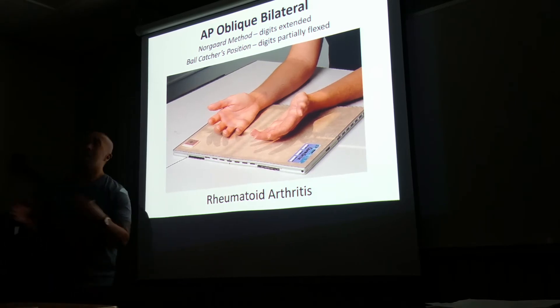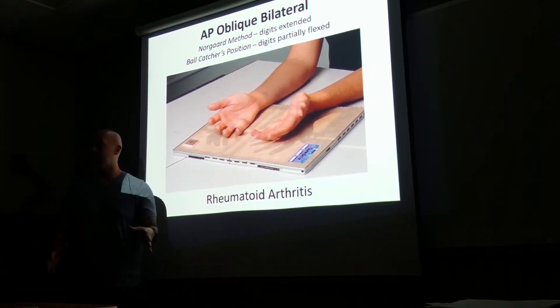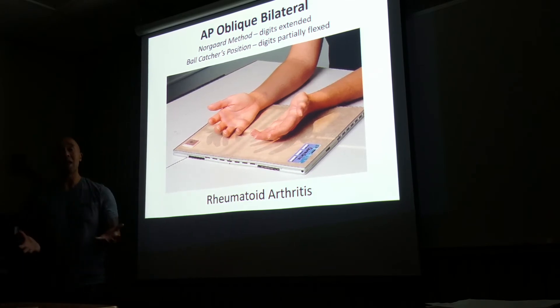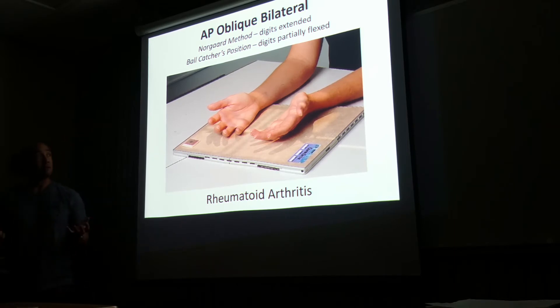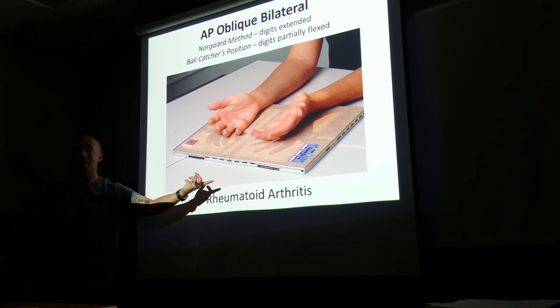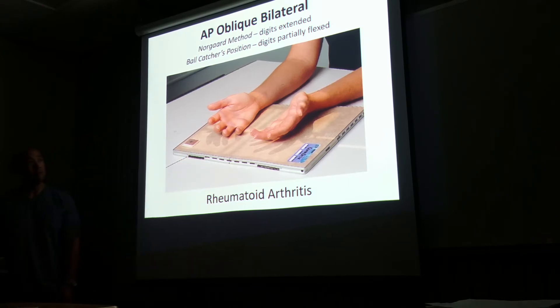We're going to open up the collimating field to include both hands. The central ray is not going to be directed at some kind of physical structure — it's going to be directed right in the middle between the two hands. For markers, just put one marker so we know which is the left hand and which is the right hand. You don't need both — that would be overkill.